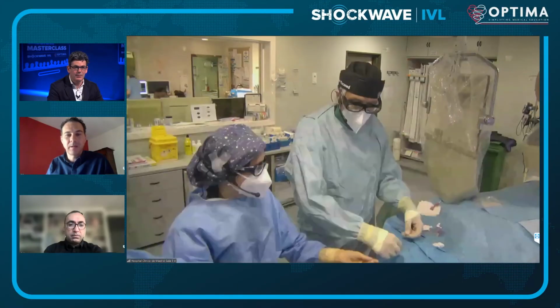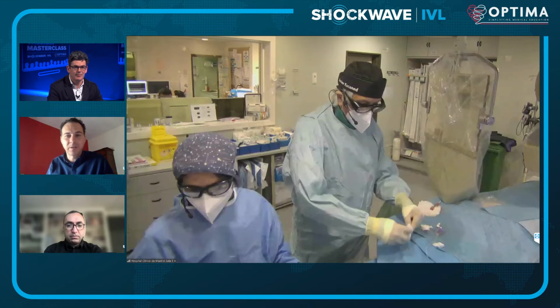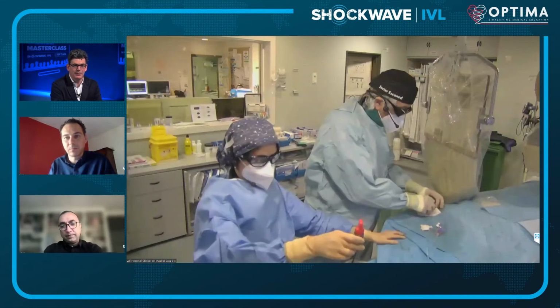And I like the philosophy of Javier and Nieves, because a priori you could say that it's dangerous to go back, but it's written in the sky, it's written on the OCT, that the amount of calcium, the deepness, the thickness tells you to crack the calcium and fracture it, and the best way to do it is IVL, definitely. So let's see what happens. We're intrigued to see this.